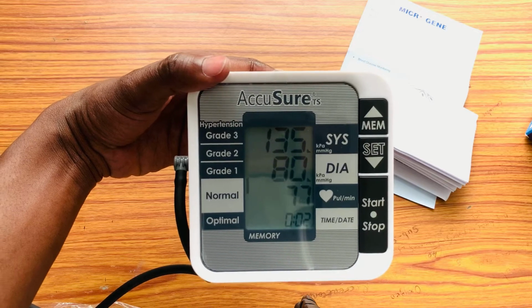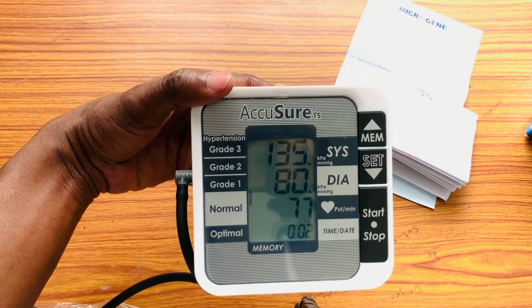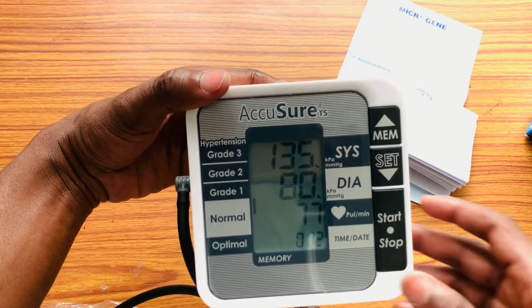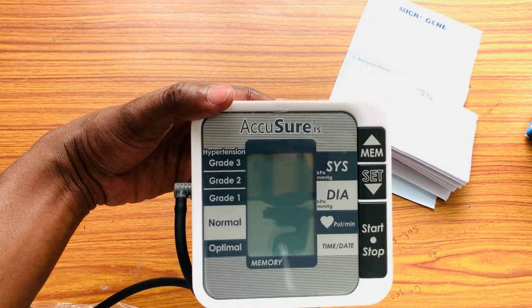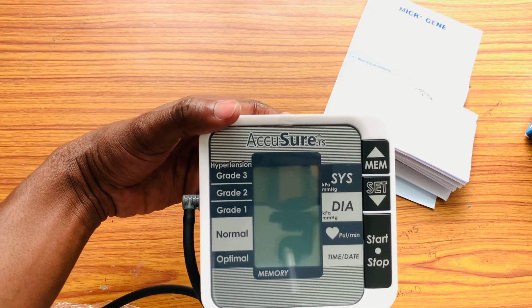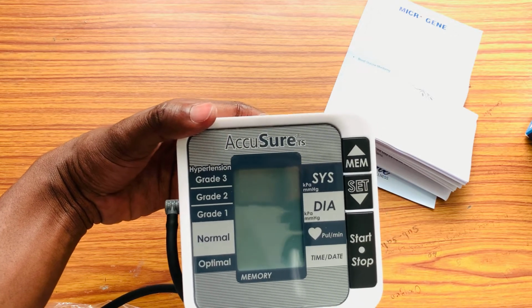The next thing we're going to talk about is how do we recall the memory. Like now, I have just monitored myself and I want to recall what was the last range. Maybe I have a patient and the patient just left and I want to recall, please, what was the reading I got from him. How do I know?